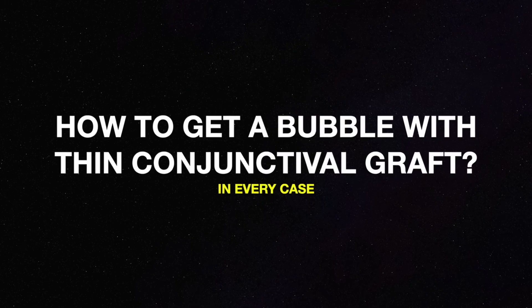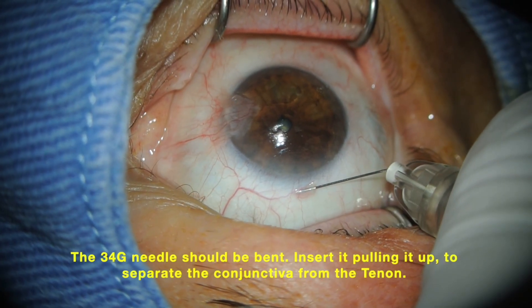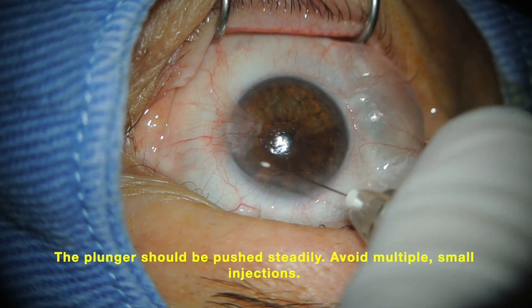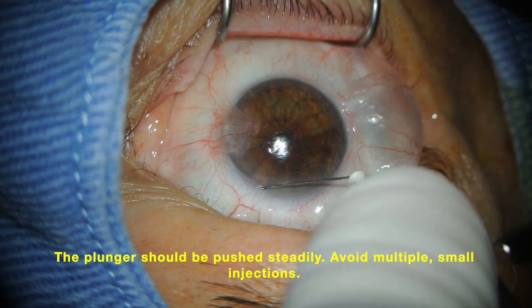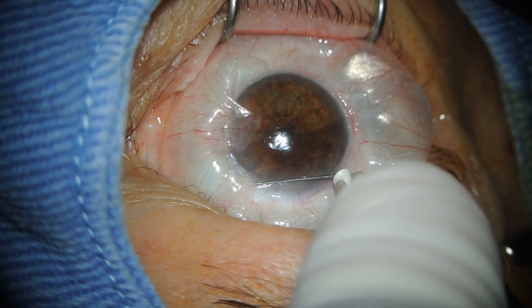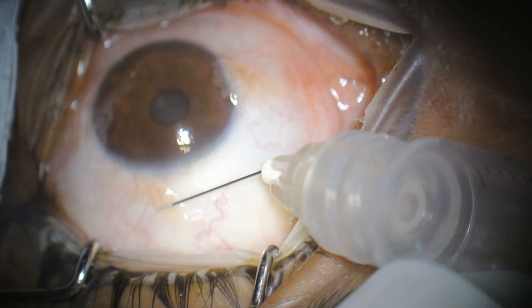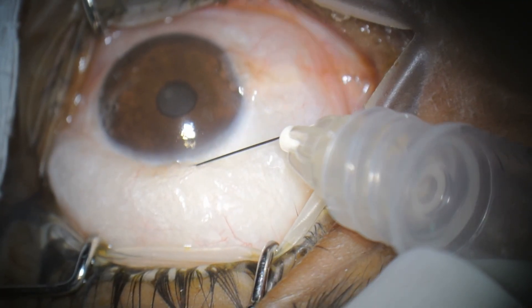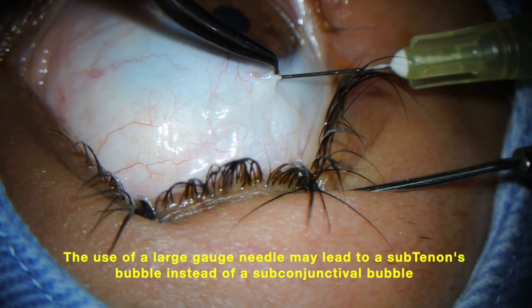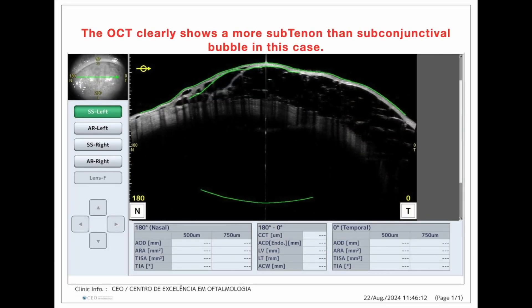How to get a bubble with a thin conjunctival graft in every case: the 34-gauge needle should be bent. Insert it pulling upward to separate the conjunctiva from the Tenon's. The plunger should be pushed steadily, and remember to avoid multiple small injections. There we have another perfect bubble. Be aware that the use of a large-gauge needle may lead to a sub-Tenon's bubble instead of a subconjunctival bubble, as we can clearly see in this OCT.